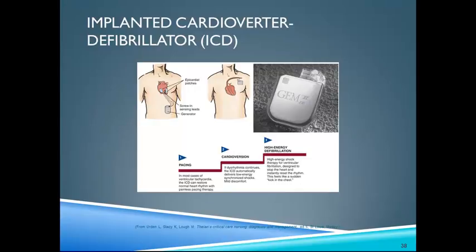Implanted cardioverter defibrillators deliver a shock if ventricular tachycardia or VFib are present. They are what we call a cardioversion, which happens when those abnormal rhythms occur, and it's designed to reset the heart rhythm.